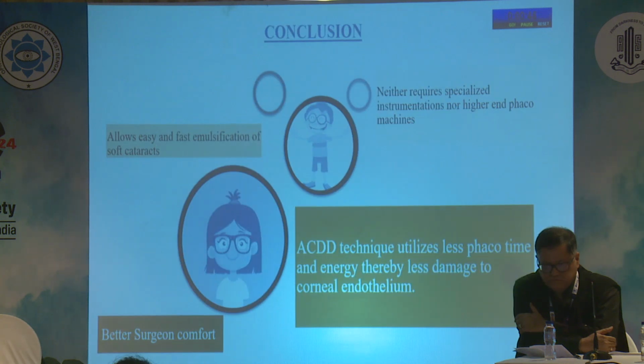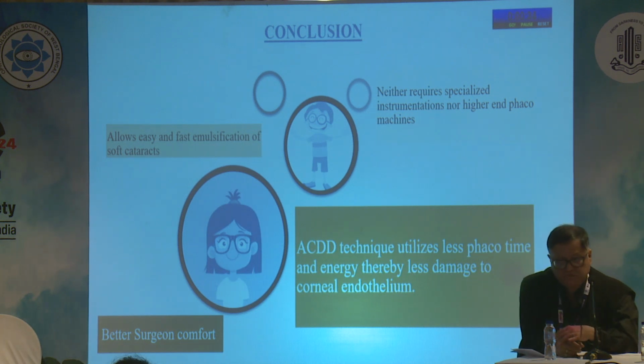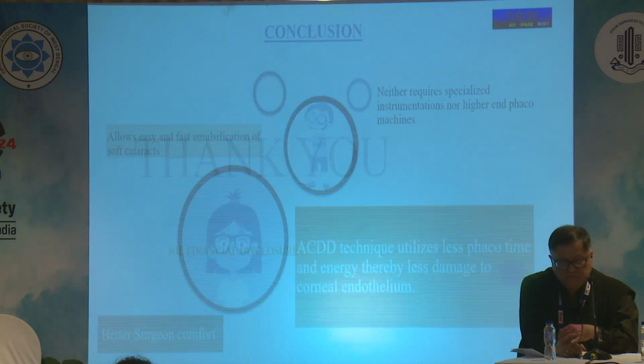To conclude, ACDD allows easy and fast emulsification of soft cataracts. It has better surgeon comfort. It neither requires specialized instruments nor higher-end phaco machines. It also utilizes less phaco time and energy, thereby causing less damage to the corneal endothelium. Thank you.